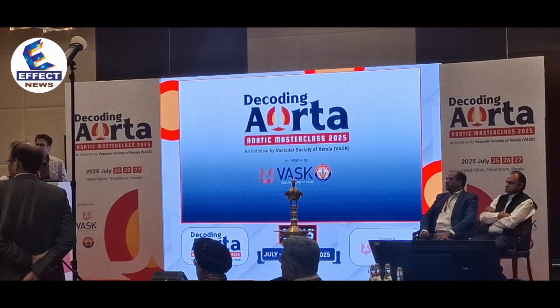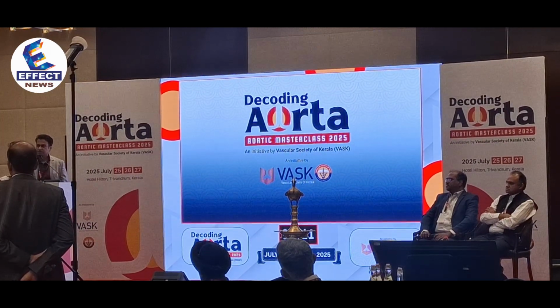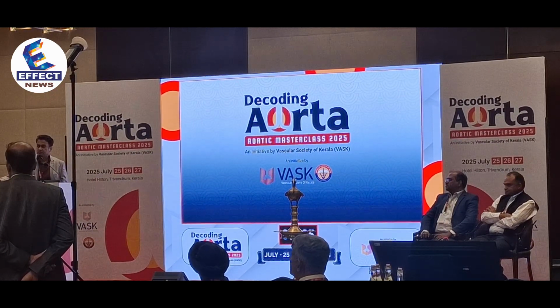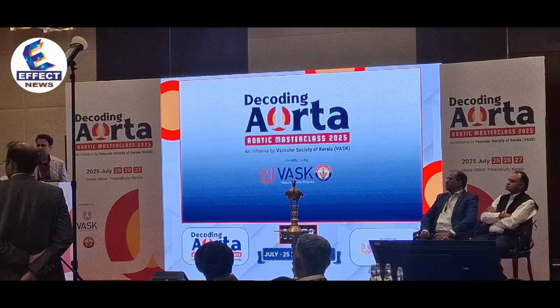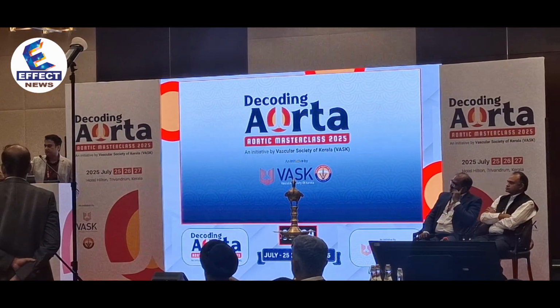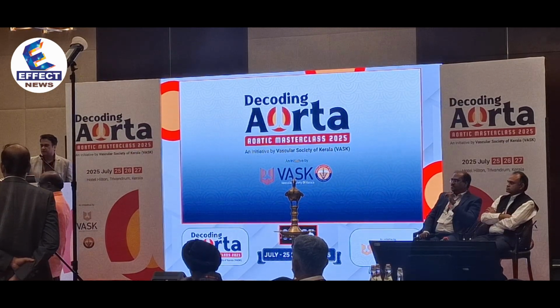CT, and you will order from the thoracic down to what level? Generally it covers the groin. So thoracic aorta, obviously to know whether there are concomitant aneurysms. So it should be entire chest, abdomen up till the groins. Till mid-thigh you can say. So if you want to cover the popliteals, you need a second one.